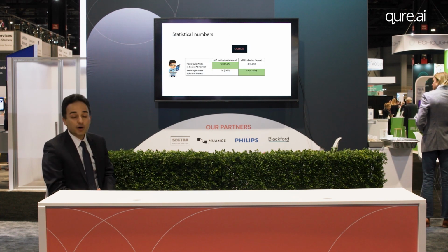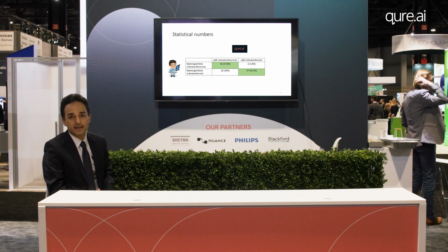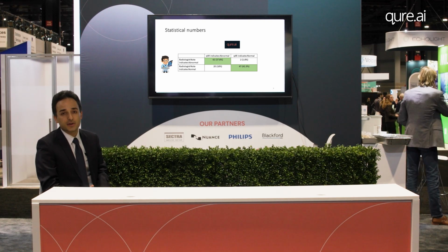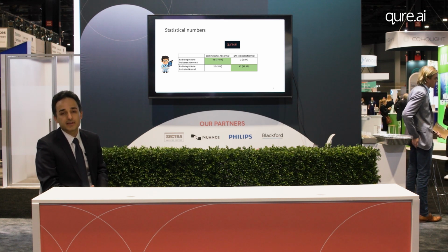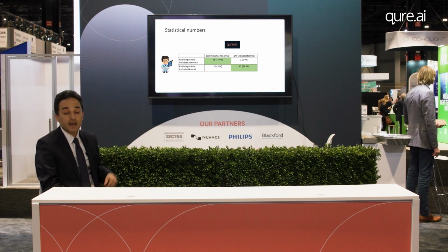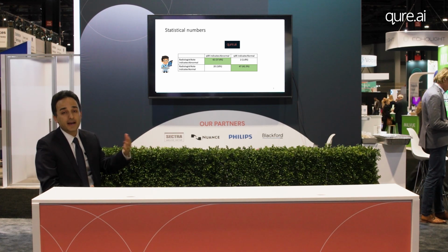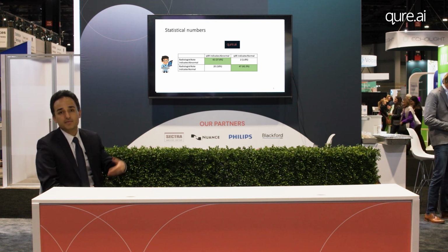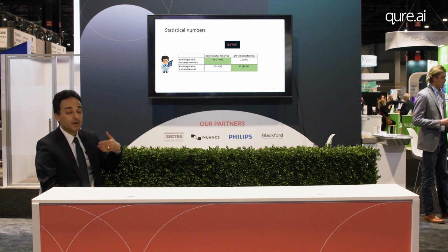Next, please. This table shows how we compared the results of the radiologists against the AI software. The rows show the results from the radiologist note, normal versus abnormal, and the columns show the results we received from the AI software. Hopefully everything falls into the green area, meaning concordance and agreement. If the radiologist says normal, the AI software says normal too, and vice versa: both of them say abnormal.